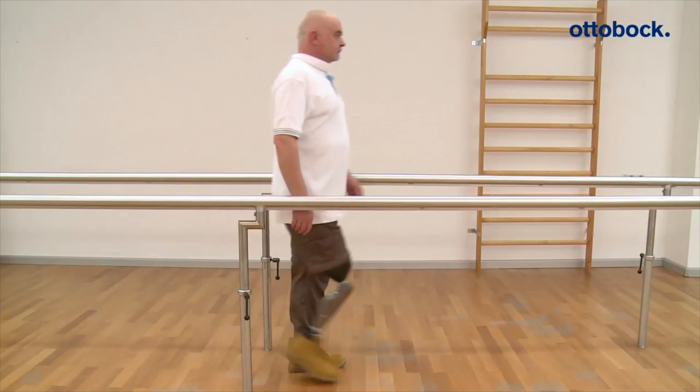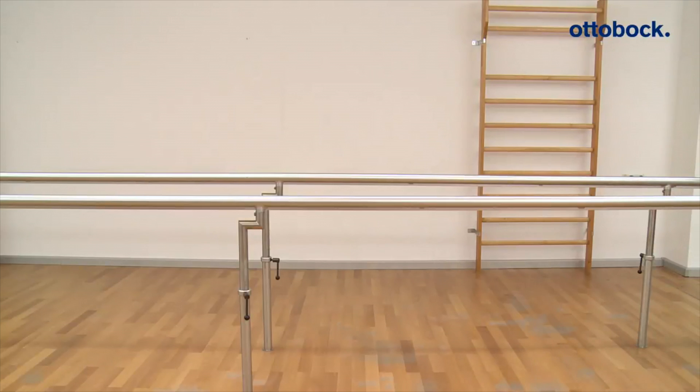If the basic resistance is set optimally for the patient, the thigh swings forward in a harmonic way.